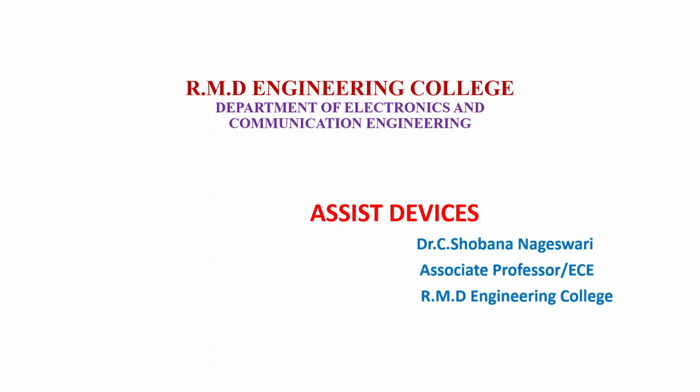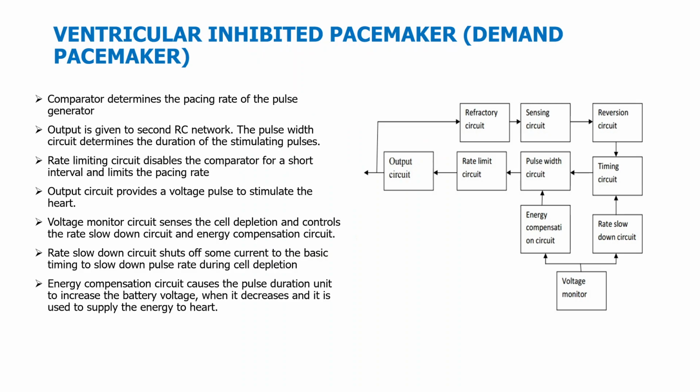Good morning. In this video, we are going to discuss assist devices, specifically cardiac pacemakers. In the first video we discussed two types of cardiac pacemakers, that is fixed rate and standby. Here we are going to discuss the remaining three types of cardiac pacemakers.